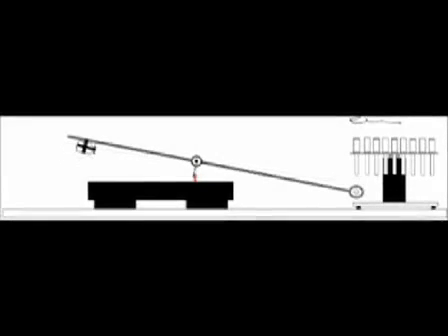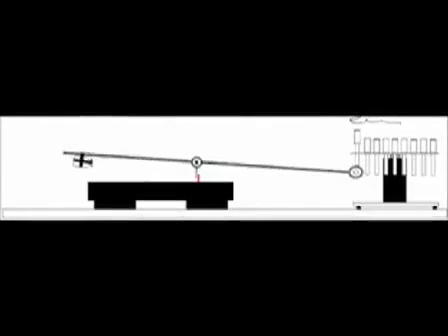Simple physics relates the speed of the actuator to the speed with which the stimulus surface rises to contact the skin, and the weight of the hanging mass to the static force of the tactile stimulus. As the actuator reverses direction to return the rod to its starting position, the stimulus piece drops. The disc stepper motor then rotates to position another piece under the finger, and the entire process repeats.